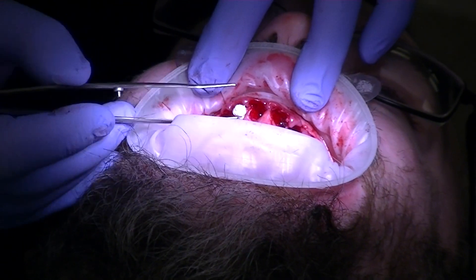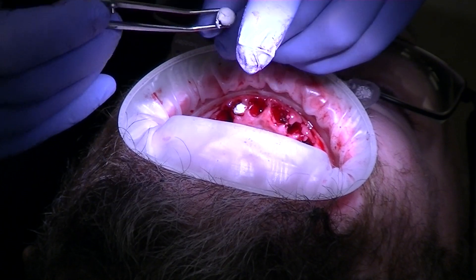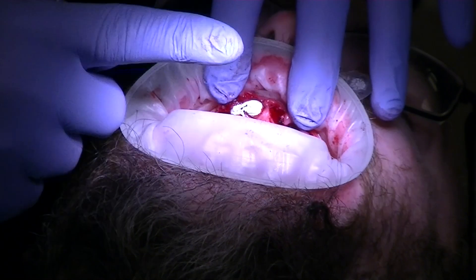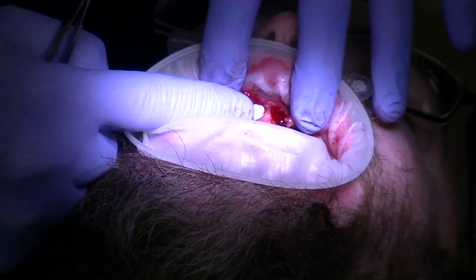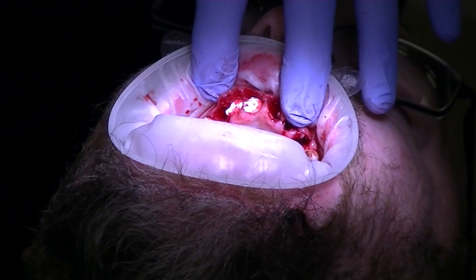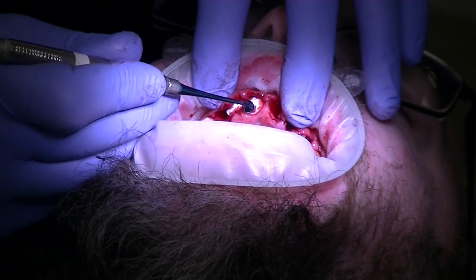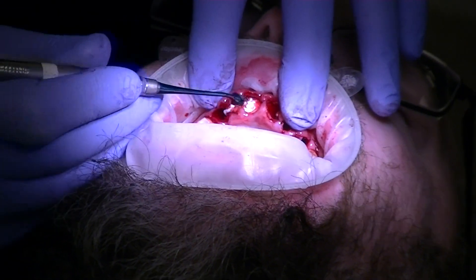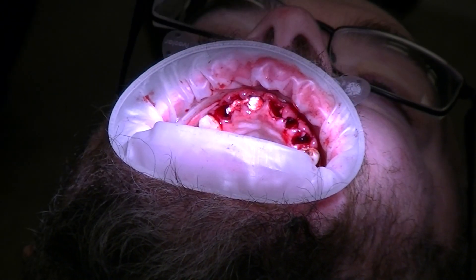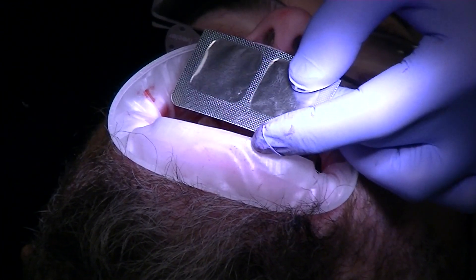We're going to take the smaller piece and put it where the lateral was, and the larger piece in the central. Open a little bit more — thank you. I like to use my finger first, then use the plugger from the grafting kit. You can see it's already starting to turn pink and nice. Now we're going to go ahead and open the bioviva.